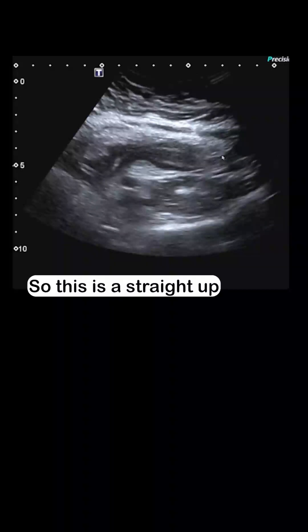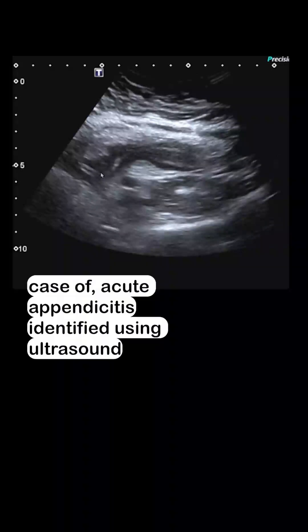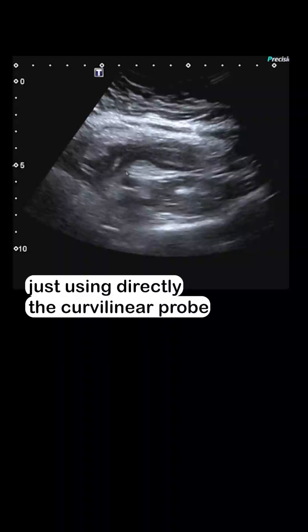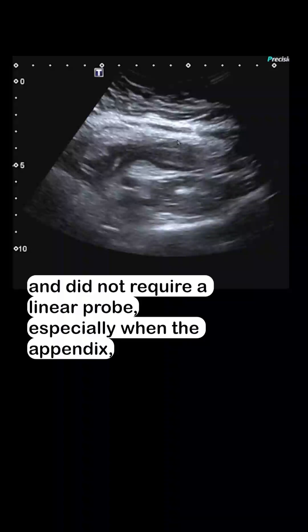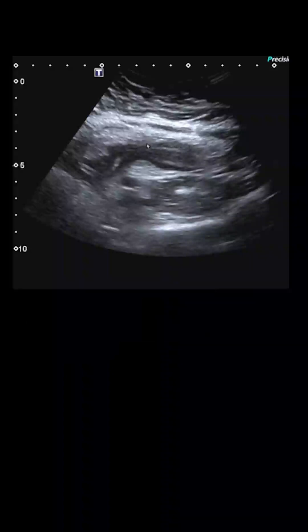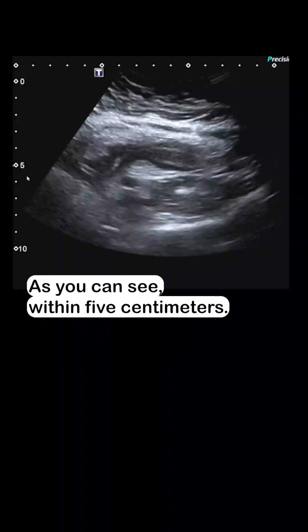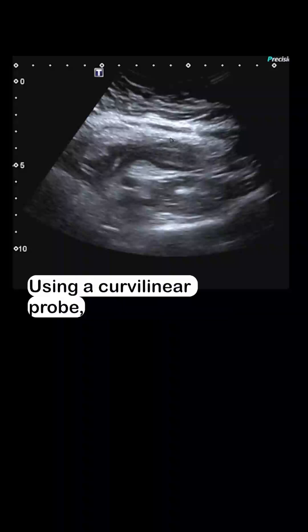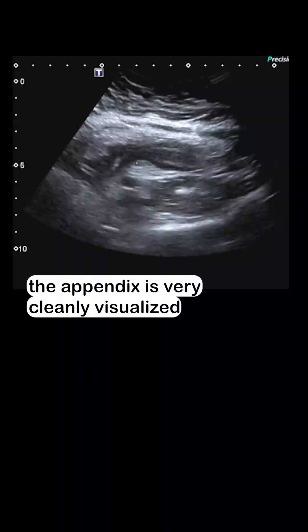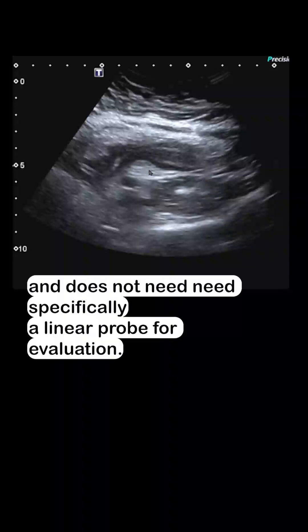This is a straightforward case of acute appendicitis identified using ultrasound, using directly the curvilinear probe without requiring a linear probe, especially when the appendix assumes an anterior position. Even at a depth of within five centimeters, using a curvilinear probe, the appendix is very clearly visualized and does not specifically need a linear probe for evaluation.